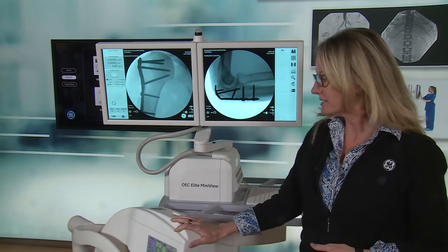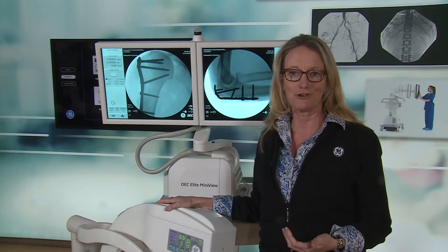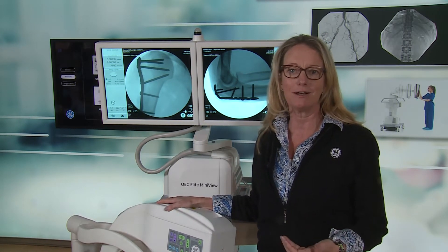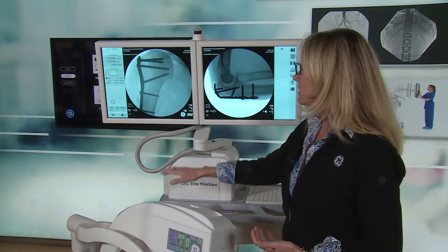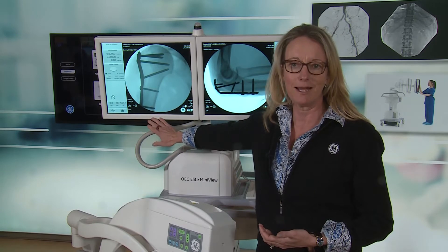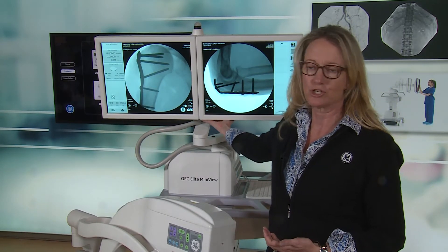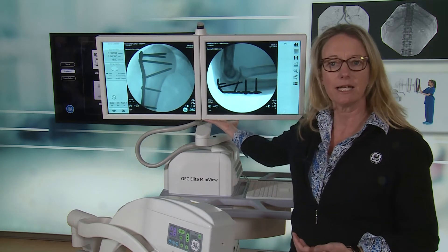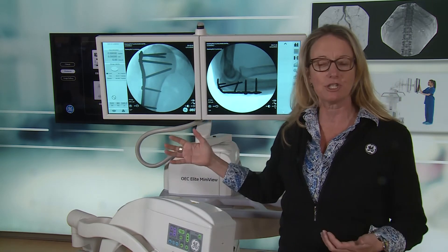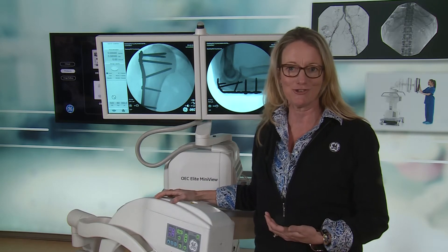One of the unique designs about this is it's designed for surgeon control, so that when they're doing their surgeries they can see the image quality and detail necessary. We feature a 19-inch monitor which enables you to show a primary and reference image of the same size for the surgeon, as well as on an articulating arm that can be placed in a position for that surgeon to receive the image quality they need during surgery.